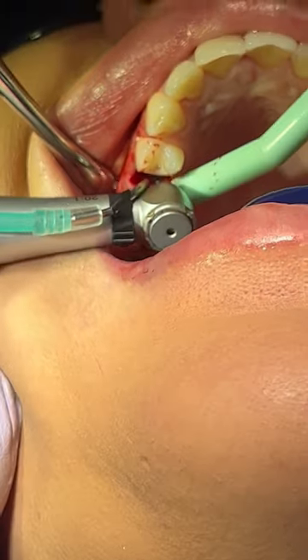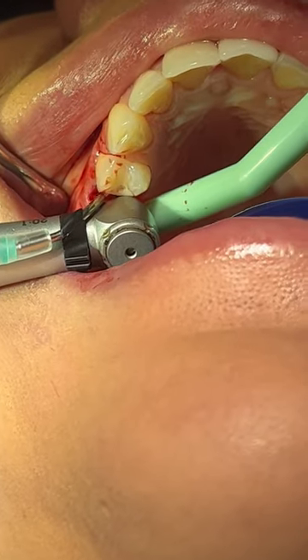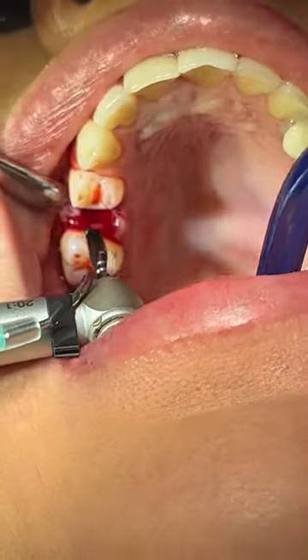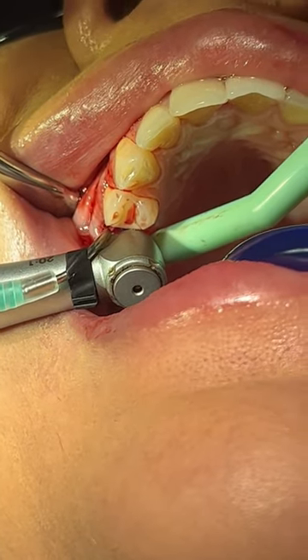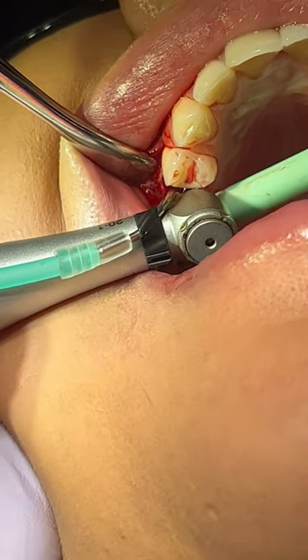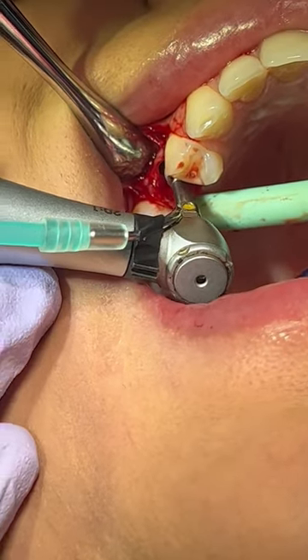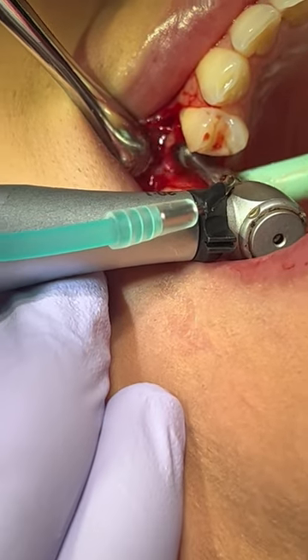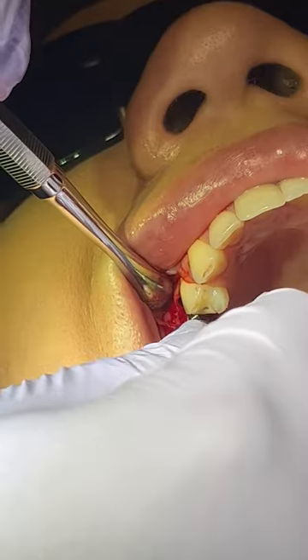Now I'm taking my implant handpiece and drills, just drilling and trying to stay within the socket. You want to be not too buccal and not too lingual — just try to see where, imagine a three-dimensional image of where the implant is going to end up. You want to give distance between the implant and the buccal plate; you want space between the two. You don't want to put the biggest implant in there. In this case, we put a 4.3 by 10 millimeter implant in there, and as you can see, there's still space between the implant and the buccal plate.